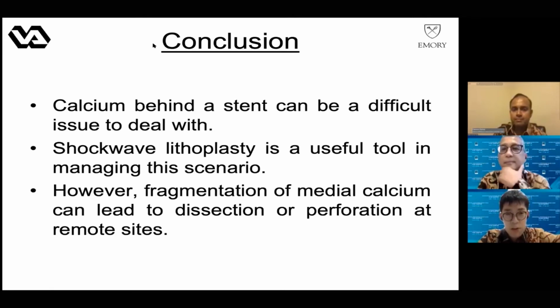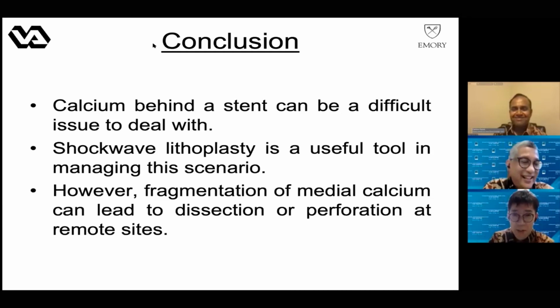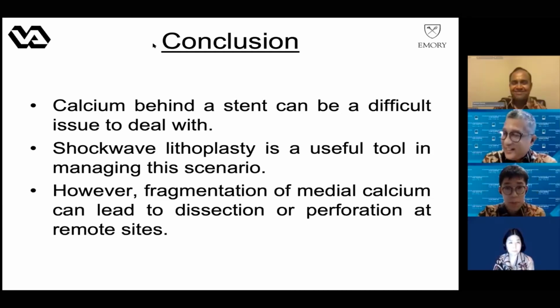My question is the indication of the excimer laser bubbling technique for this region. Are you asking me? Yeah. Okay. Everybody can answer that. Sure. We reported, we compared this type of cases, picking up by OCT about 30 cases which had stent underexpansion due to the calcium behind the stent.